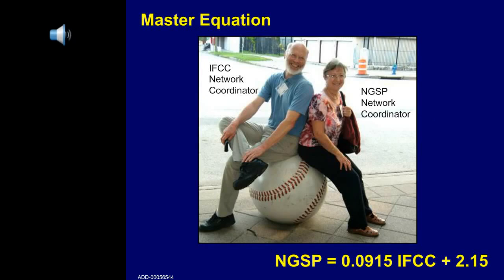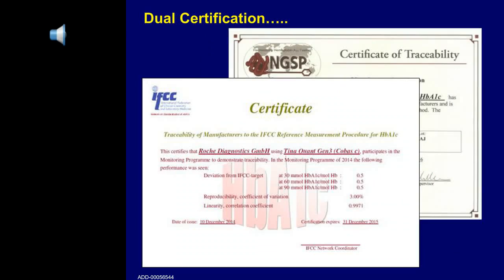Fortunately, as IFCC network coordinator, I have a good relation with Randy Little, the NGSP network coordinator, and twice a year we exchange samples between both networks to be sure that the master equation, this is the equation to convert from NGSP to IFCC and vice versa, is still correct. And at the bottom, you see this equation. Also, dual certification, IFCC and NGSP.